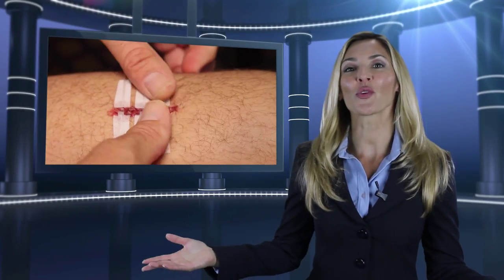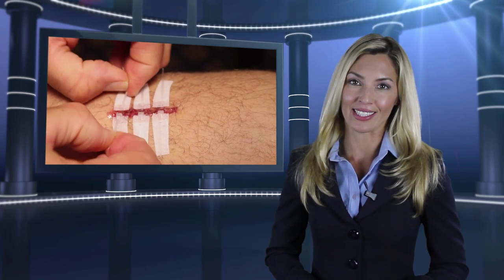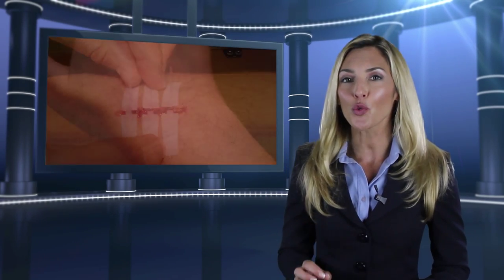This is truly a revolutionary product. Now you will achieve a true closure and great cosmetic outcome without the time and cost associated with hospital visits and sutures. Doctors love it and patients do as well. I recently had surgery and the doctor used Dermalock instead of staples or sutures. I didn't experience the itching and the pulling during healing as I had in the past with other skin closure methods.